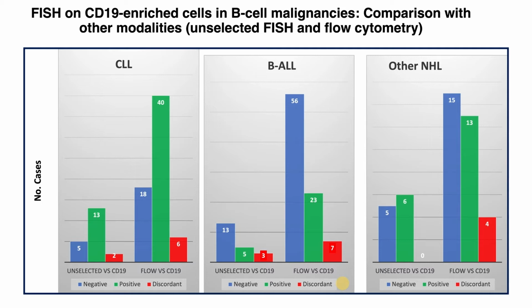So despite the fact that the promise of CD19 FISH is clear, several key discrepancies between various modalities were seen in this analysis. So I want to address these similarities and discrepancies in this slide.